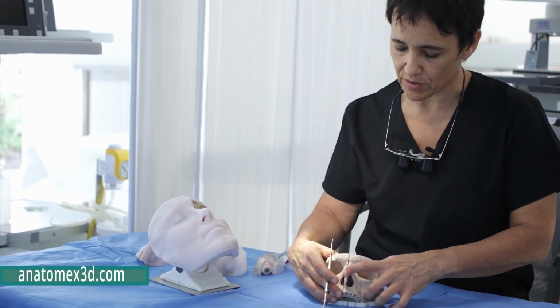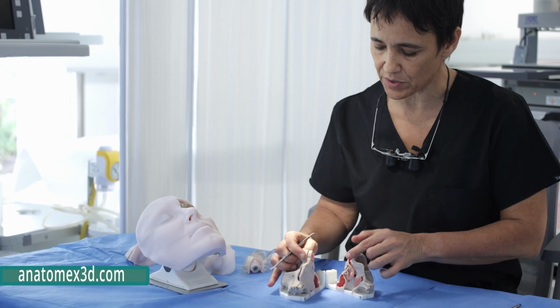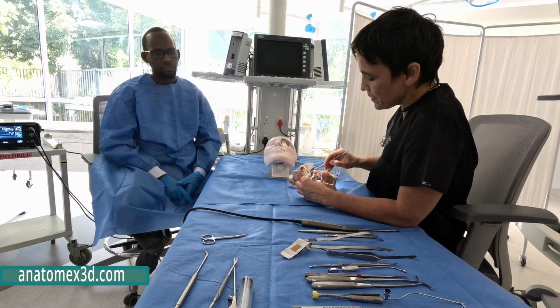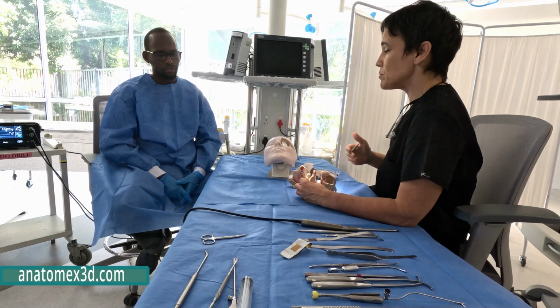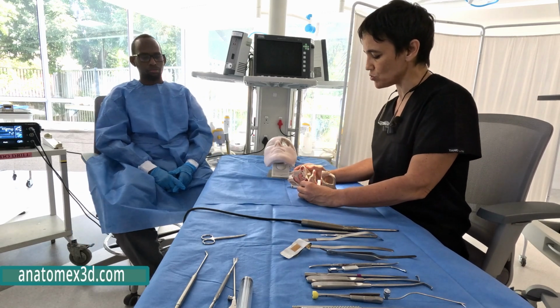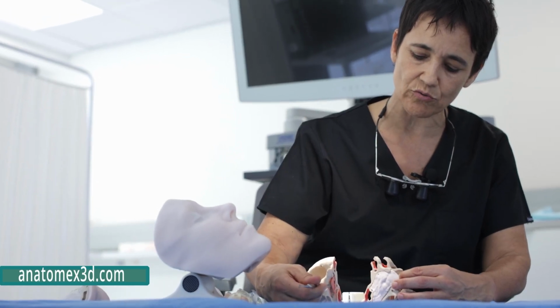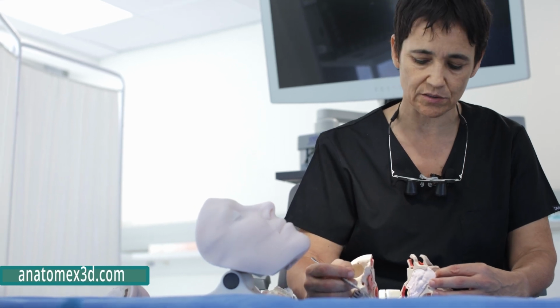Then you have special sinuses between your eyes, called the ethmoid sinuses. This is the area behind the middle turbinate and behind the superior turbinate. In this little space is where, if people have nasal polyps, polyps will grow from those sinuses. So in order for us to do surgery, we have to slide into this little groove with our camera and make space to get to those tiny sinuses.